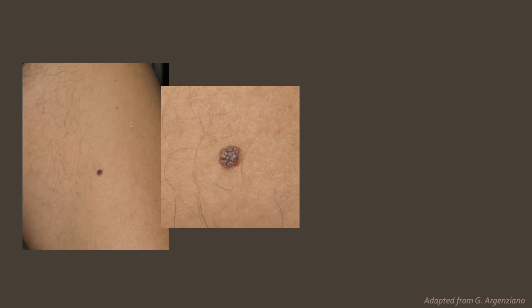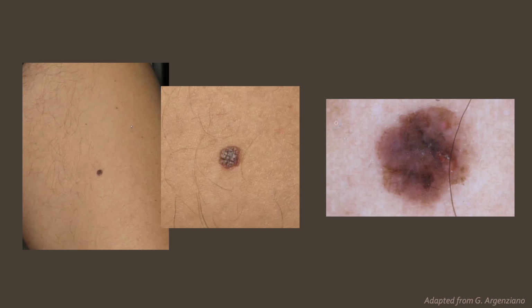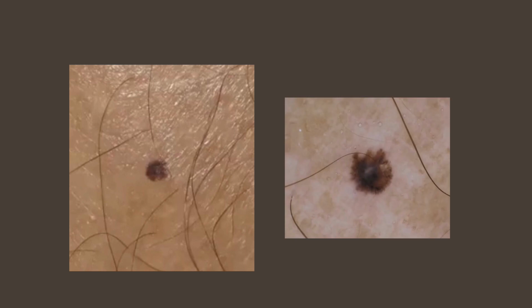Another one, quite a banal looking, very small, tiny nevus with maybe slight irregularity of border on one side. But on dermoscopy examination, this was a melanoma. Here is another one, a very tiny nevus with slightly irregular borders. But again, on dermoscopy, this was a melanoma.